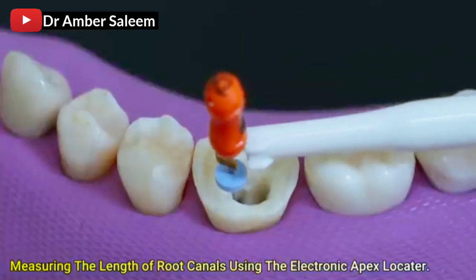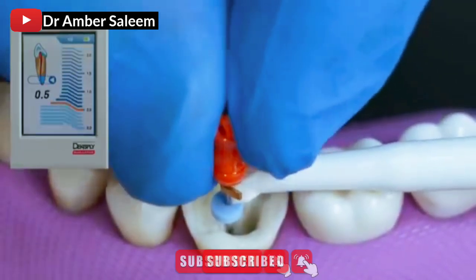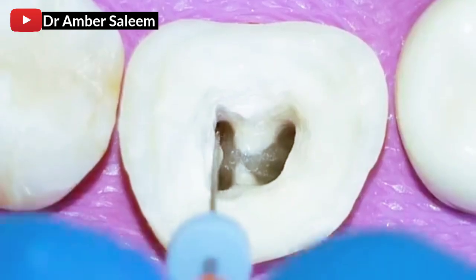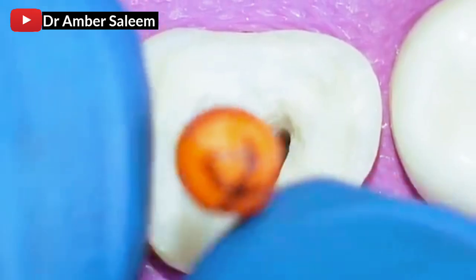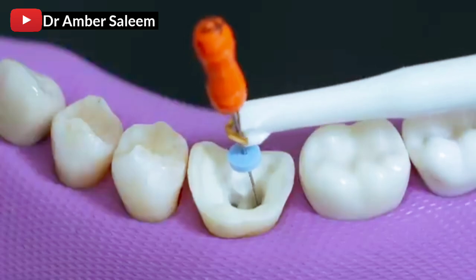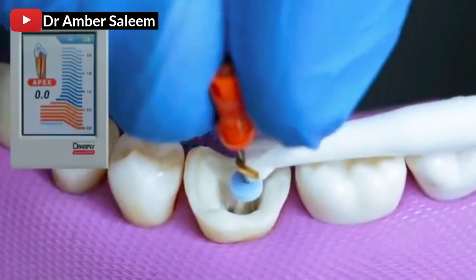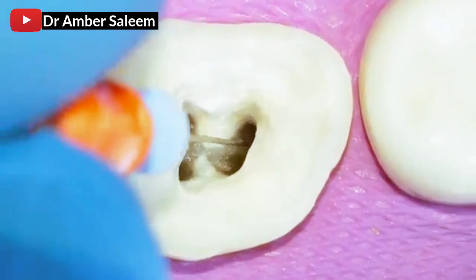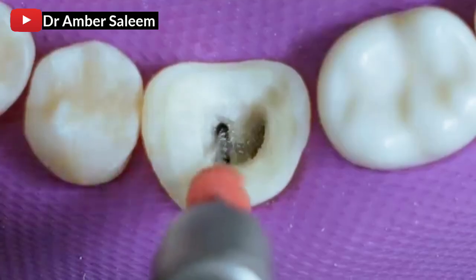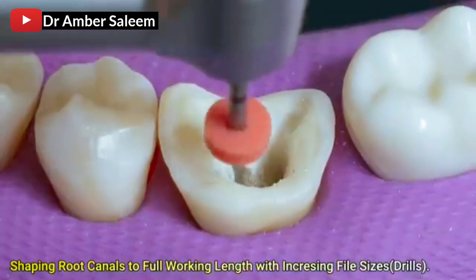Measuring the length of root canals using the electronic apex locator. Shaping root canals to full working length with increasing file size drills.